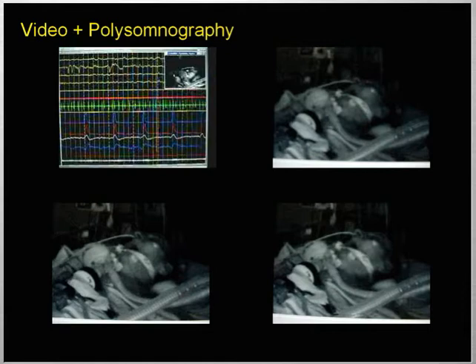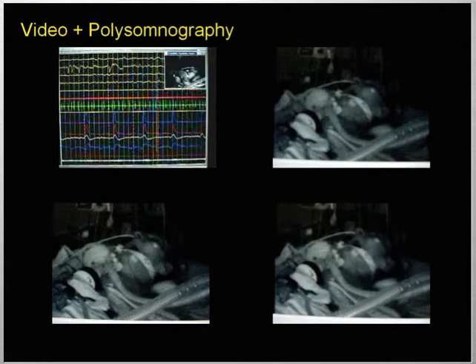But what follows immediately after that is this. And you can see that the patient takes in a breath and prevents the apnea alarm from going off any further, moves a little bit and tosses around, and the ventilator starts cycling again.